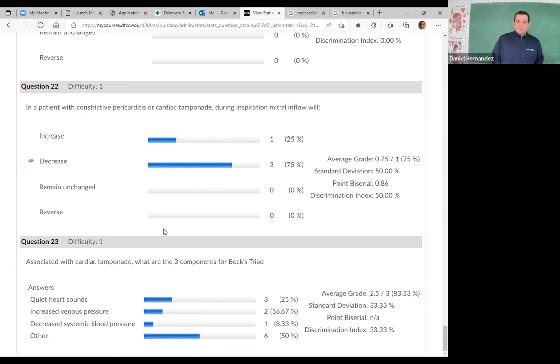So this is again our respiratory variation, like with constrictive pericarditis and tamponade, what we look for. I just kind of focus on the right side of the heart first, because it's easier to just memorize what's going on the right side, particularly because that's the side that's going to be affected first. So if I know the right side, I just kind of flip it for the left side. So with tamponade, I remember inspiration. We're just talking about tricuspid flow now. With tricuspid valve on the right side, inspiration will increase my spectral tracing, or augment, make it larger.